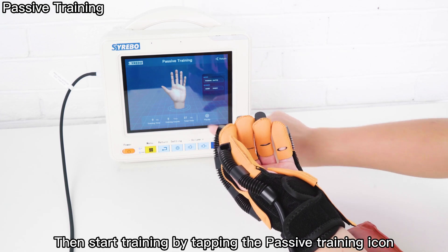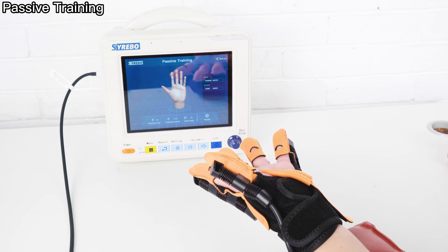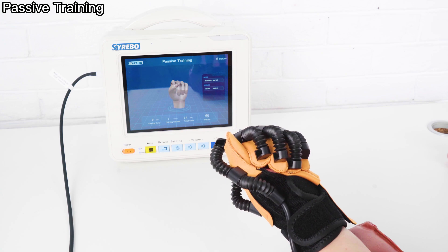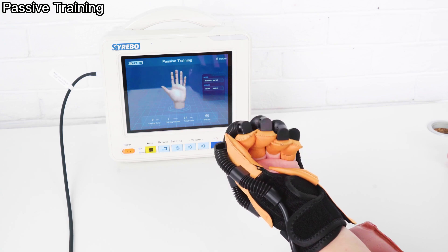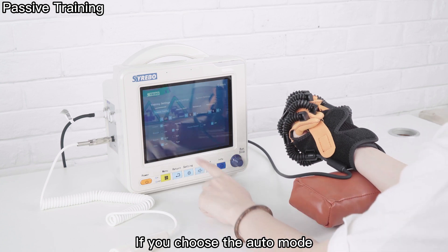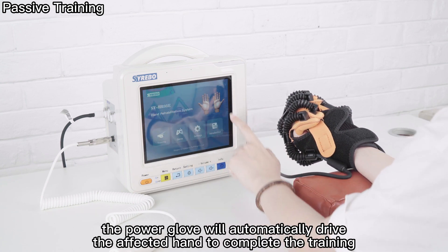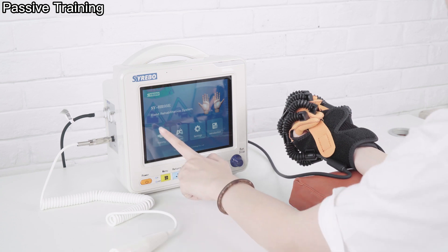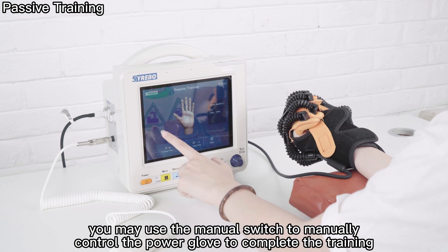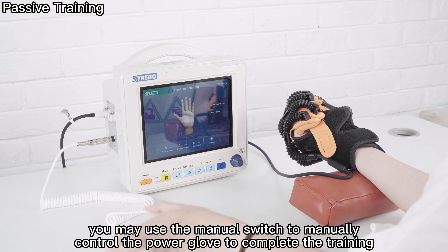Start training by tapping the passive training icon. If you choose auto mode, the power glove will automatically drive the affected hand to complete the training. If you choose manual mode, you may use the manual switch to manually control the power glove to complete the training.